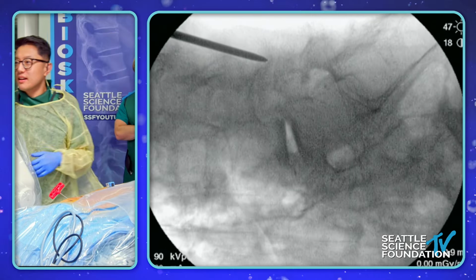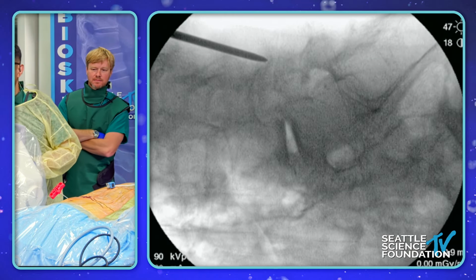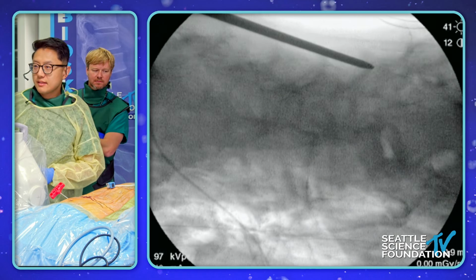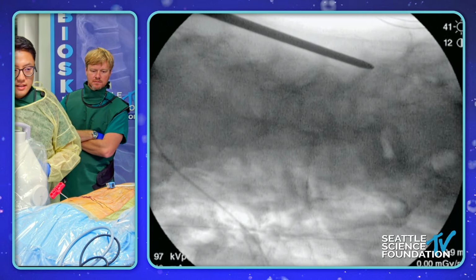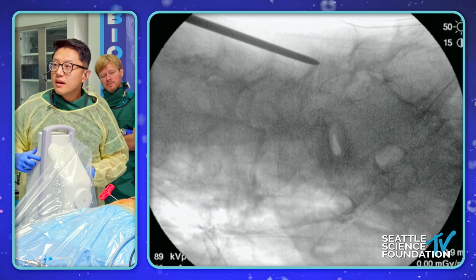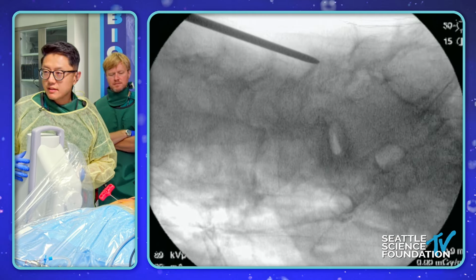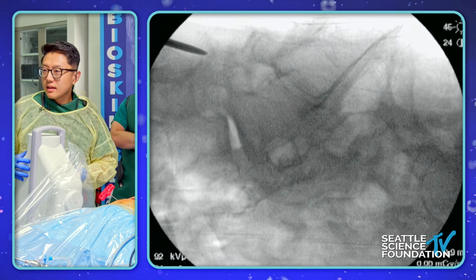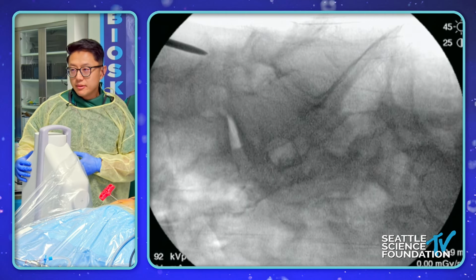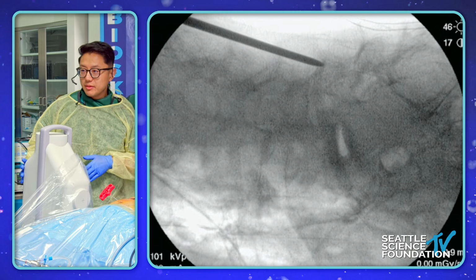Okay, that's better. Let's try and wag it a little bit. This way, maybe? Yeah. And then slide the machine throttle. You've got to lock the light, yeah. Shot there. Okay, that looks better. Let's take one more there. Do you want to get a quick AP too? Okay, so slide back up. Do you want to get a quick AP? Yeah, we will. Shot there. Yeah, because I think this is about as good as we're going to get.